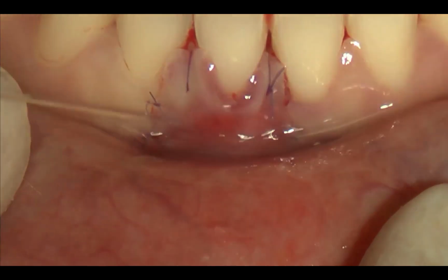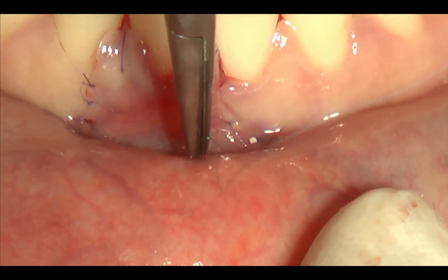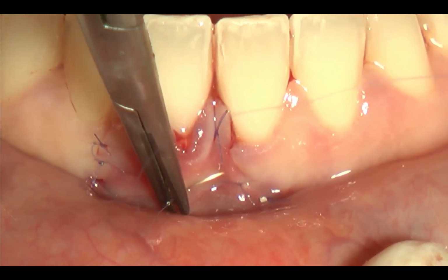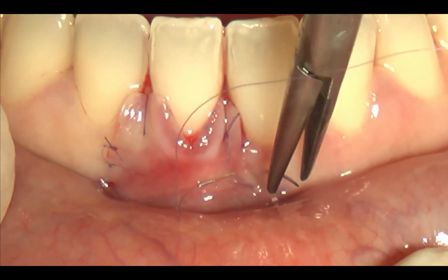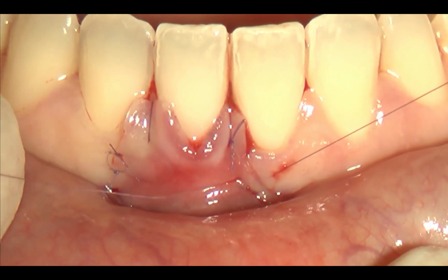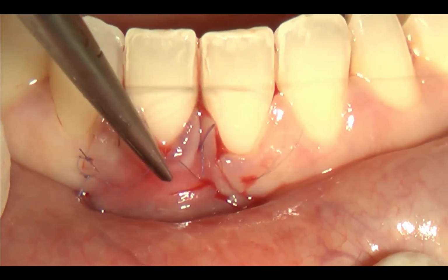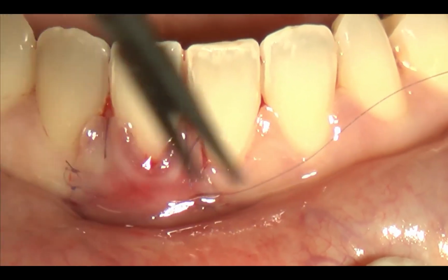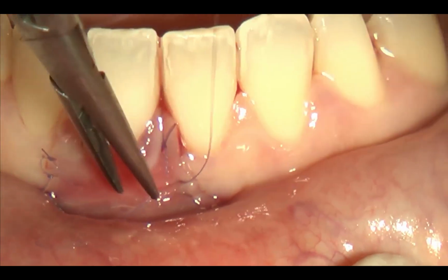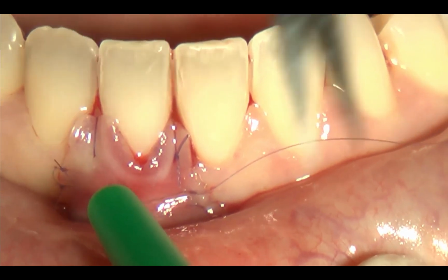Right. You see that there is sometimes some bleeding escaping from the soft tissue margin, and this is something that we have to solve with the last suture. That is the one that will adapt, as a cord, the keratinized tissue to the convexity of the clinical crown. Because the first suture I did, the sling one, was only used to fix the papilla in position, not to obtain stabilization of the blood flow.